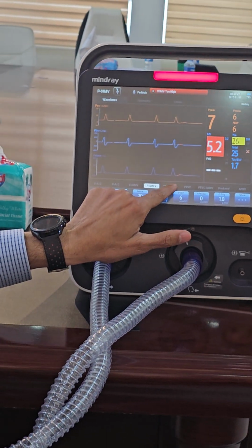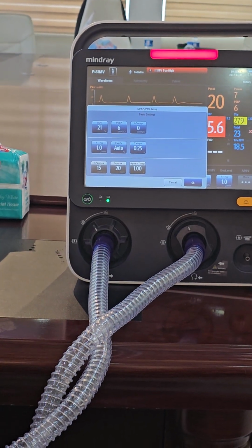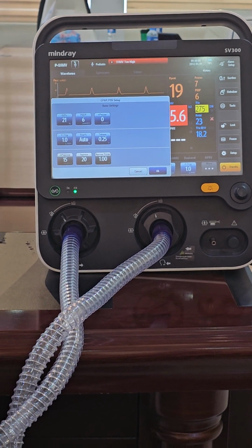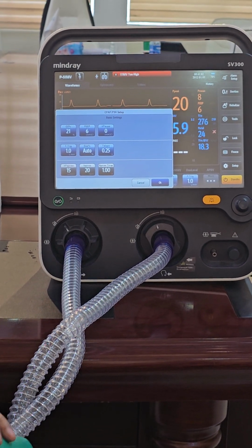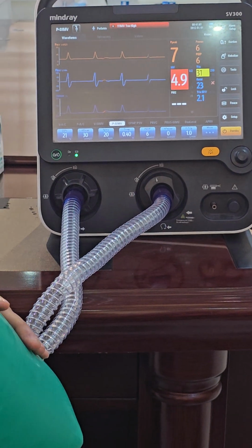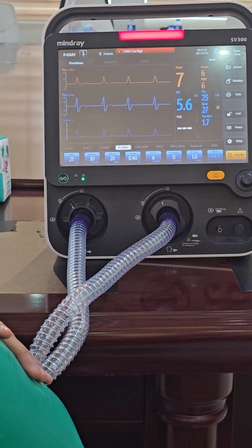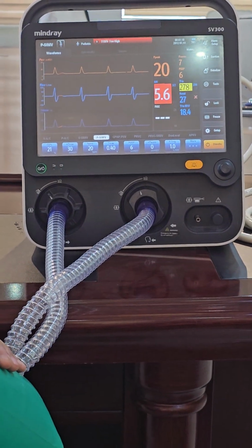And then we have PSV and CPAP. Pressure support ventilation is this mode. The difference here is that it's the same as SIMV or assisted control, but instead of time control, it is flow control. You understand? What is flow control? In time control, we set the ventilator to breathe in within 0.35 or 0.4 or 0.65 seconds. So you do it within this time. That's called time control.